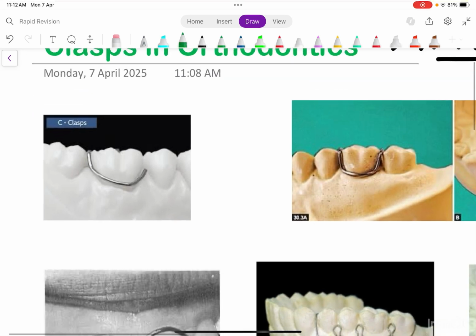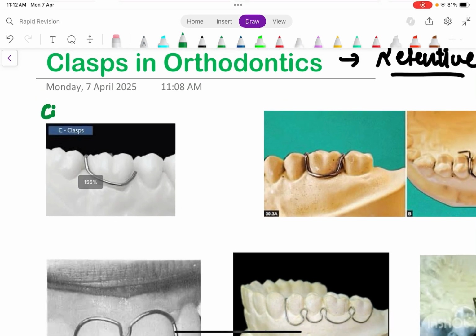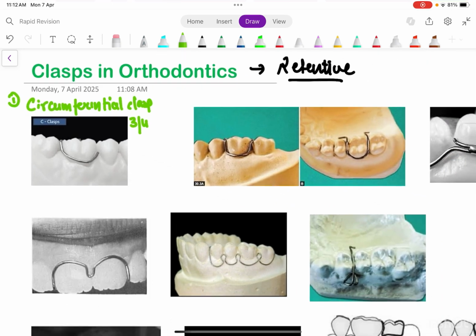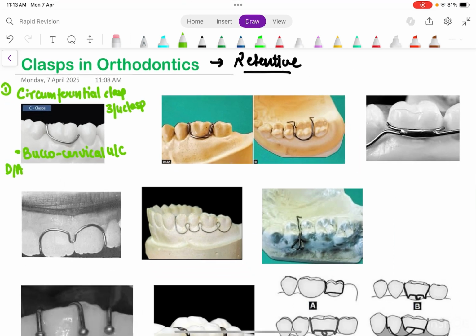The thing about this is that it is basically a circumferential clasp, and it is also called a 3/4 clasp. All right, then you should know the undercuts that they involve. In this you can see that it involves the bucco-cervical undercut.